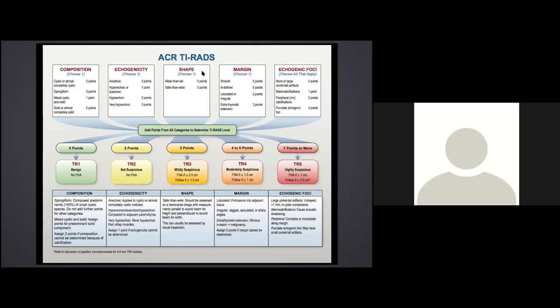The general recommendation is if these nodules are more than 2.5 centimeters, you sample them, do a fine needle aspiration. If they're between 1.5 to 2.5 centimeters, then you follow them. So if it's less than 2.5, you do a follow-up ultrasound.